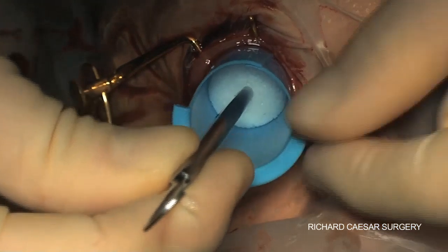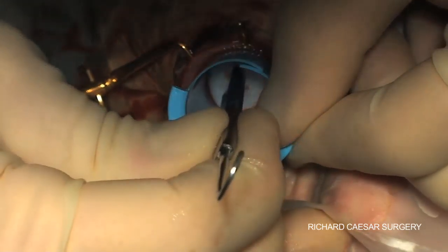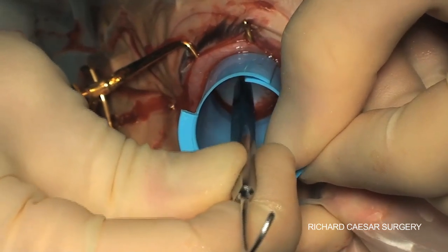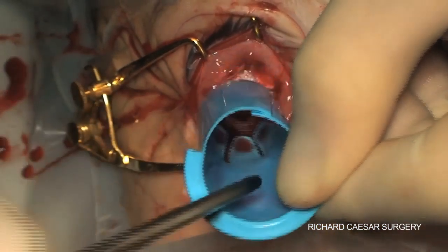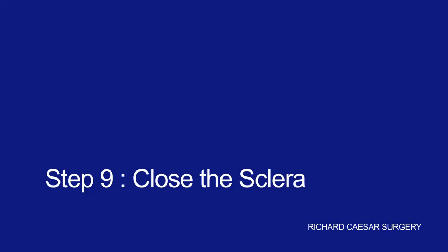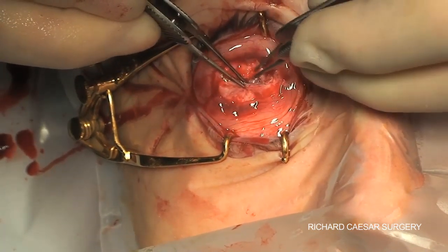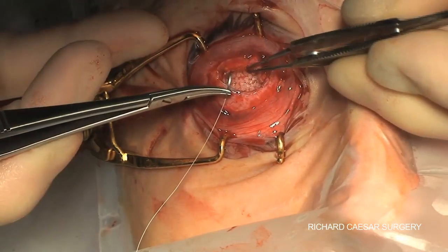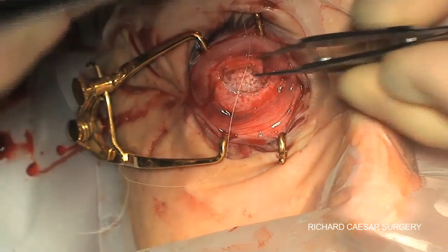Tucking the inserter into position, you then push the ball right down to the bottom and hold it down while lifting the inserter back out. Obviously the spherical surface of the ball can make this a little tricky, but the key thing is keep the ball down while the inserter lifts, and then the sclera will be advanced around the ball and will close easily without any tension. You can either trim the edges or overlap the edges — here I'm tucking the superior sclera underneath the inferior sclera — and then using a 5-0 Vicryl to close the sclera.